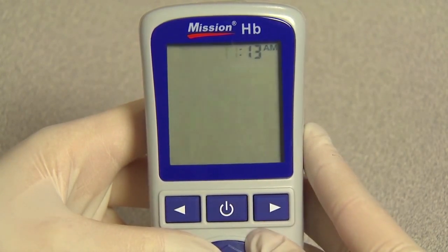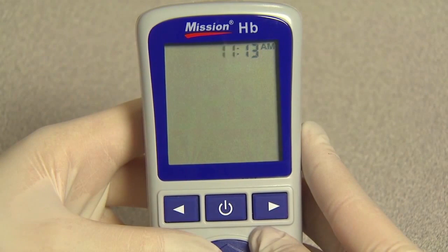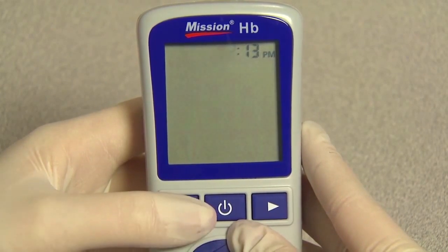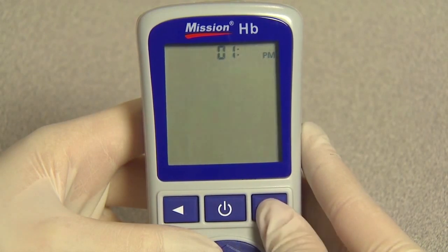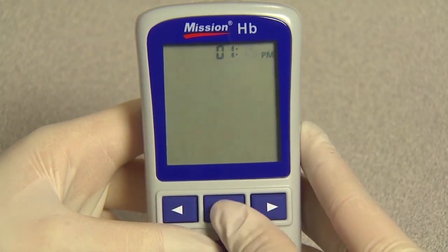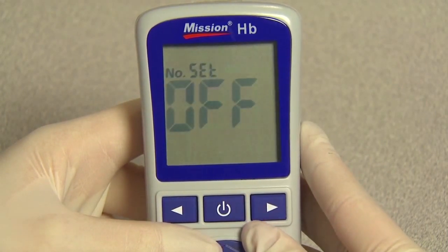The hour and minutes will appear at the top of the display. They will be separated by a colon with flashing hour. Press right or left until the correct hour is displayed. Press the power button to save and proceed to minutes. The meter will display AM or PM if the 12H time setting is chosen. Minutes will flash. Press right or left until the correct minutes are displayed. Press the power button to save and proceed to test number reset setup.